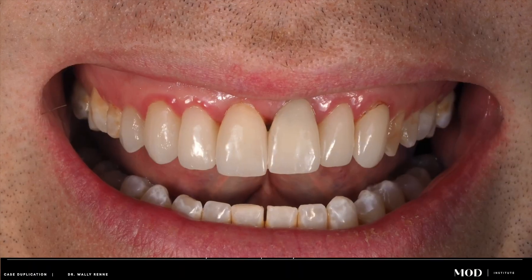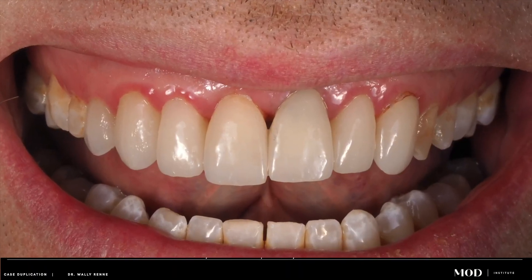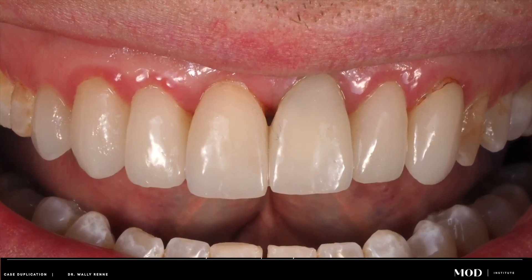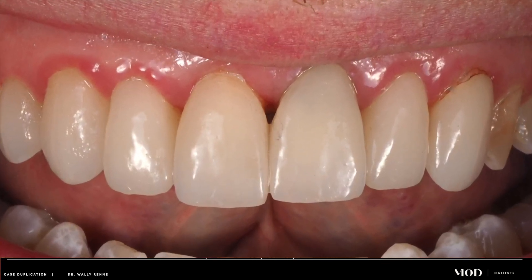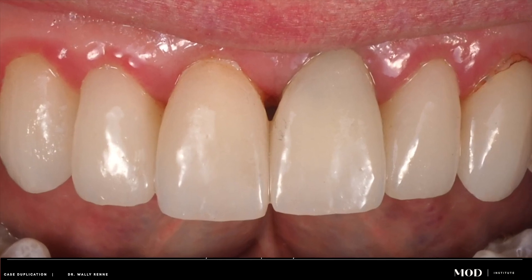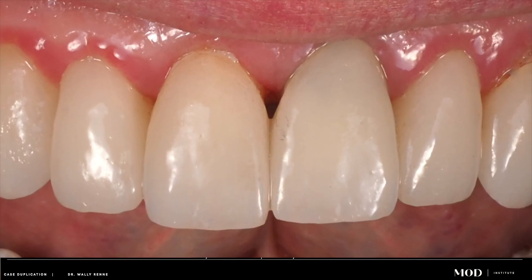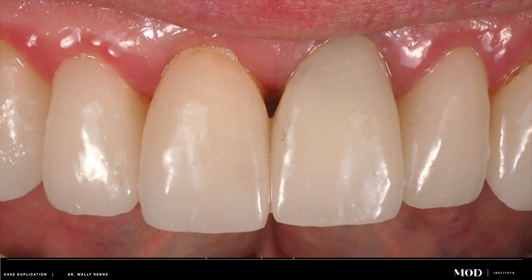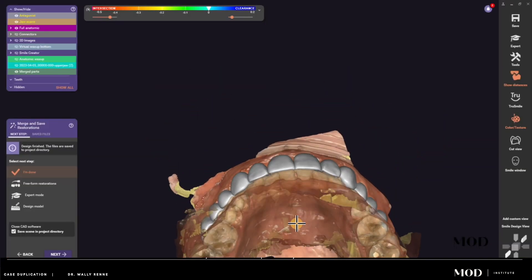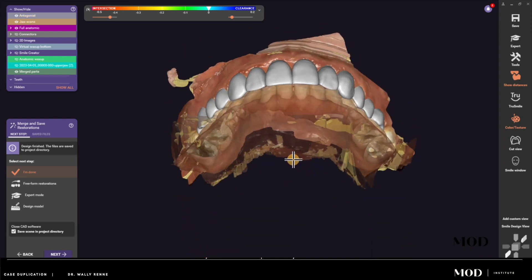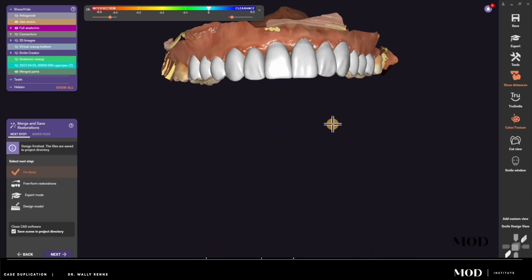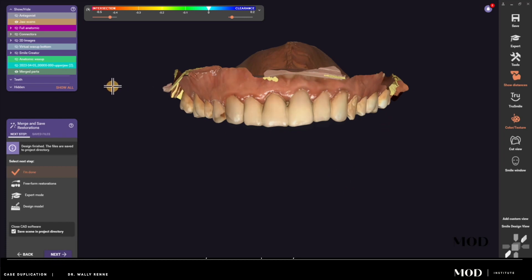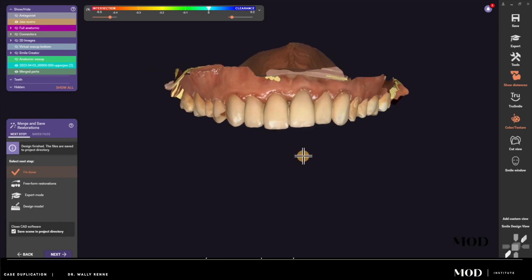This is one of the most important tutorial videos I've ever made. We have some failing restorations that were previously done — debonded veneers, beautiful initial feldspathic restorations, crowns on teeth 7, 8, 9, and 10 with veneers on the cuspids back to the premolars. I did a diagnostic wax-up in Exocad for this patient, who happens to be a dentist, and I virtually prepared the model, doing simulated crown lengthening on teeth 6, 7, and 8 — just very minor.